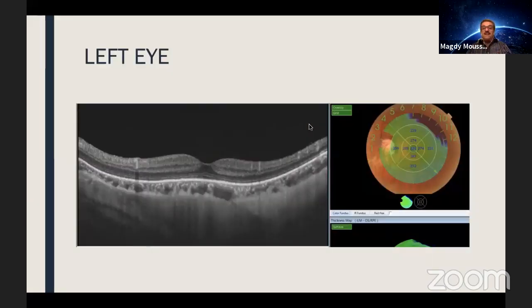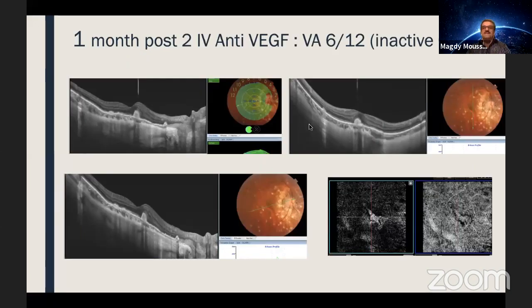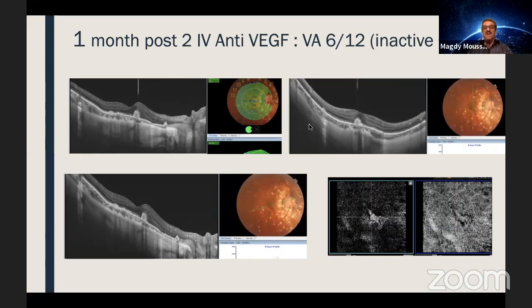The left eye shows nothing — only myopic contour. She has 6/6 vision in the left eye and is not complaining about it. Multifocal choroiditis is sometimes unilateral but commonly bilateral. PIC is also bilateral but sometimes presents unilaterally. I started anti-VEGF because in the literature it can be used for inflammatory CNV and is very helpful. After two anti-VEGF injections, vision regained to 6/12. On OCT we don't see much thickening. The lesion is getting smaller with minimal flow on OCTA.